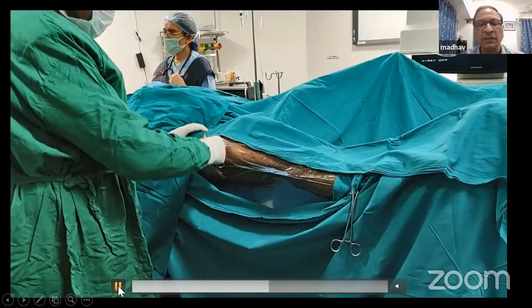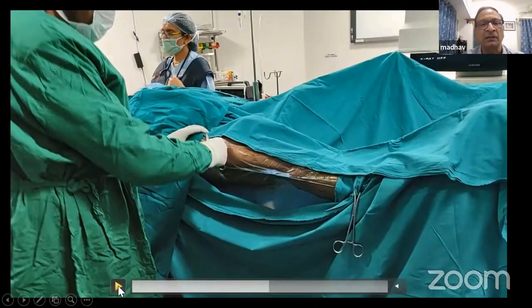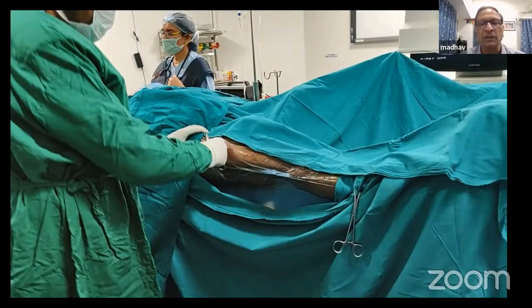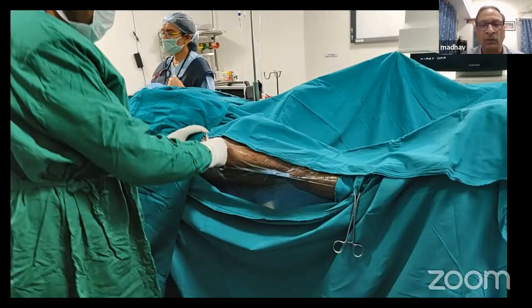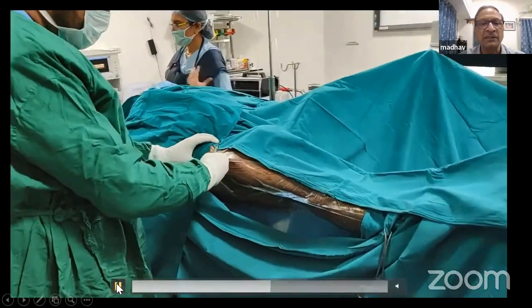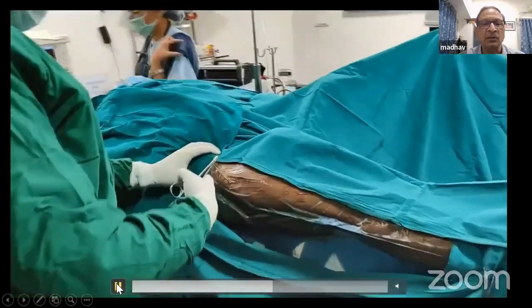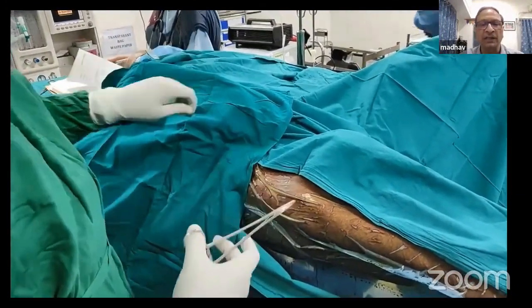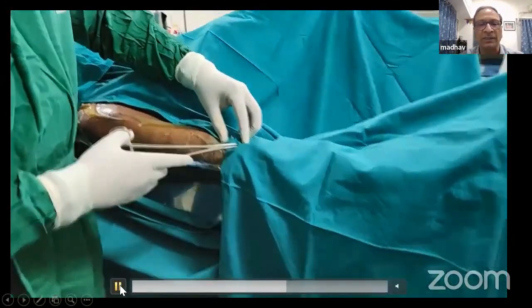Then you suture these ends. Stitches are taken to secure these big sheets, which have come from all sides — one from above, one on the opposite limb, and one on this side. All of them are secured in place by stitches or ethylon stitches, which you take through the sheet and superficially through the skin.